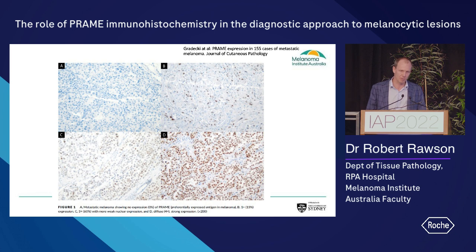Some are intense, some are a bit weaker. How many of those cells are staining positive? I think that's quite difficult to estimate, and I think there would be quite poor inter-observer reproducibility on B and C. Probably C is thought to be around 3+, but I wonder if more than 75% of them are staining, but some of them are just weak, and B is sort of 1 to 2+. But if something looks like D, that's obviously a strong positive staining. It's B and C which I have difficulties with, and I'll talk about that later.